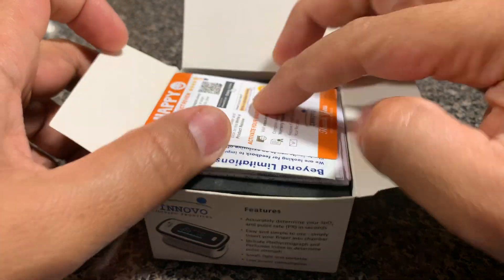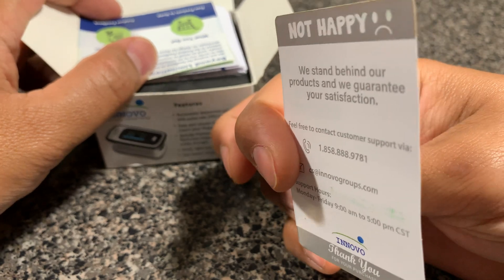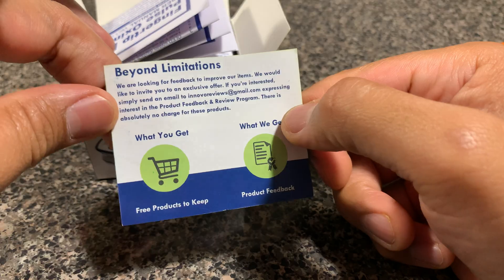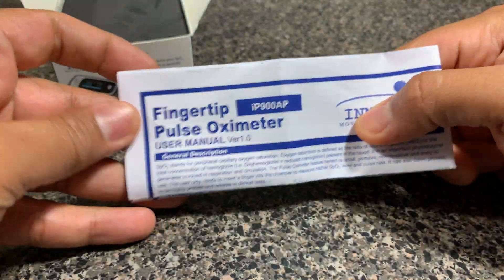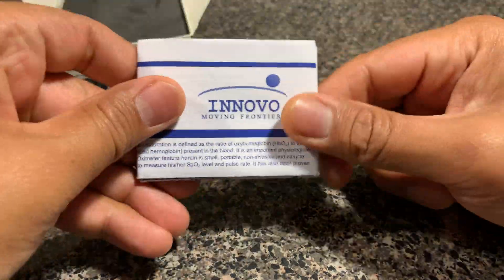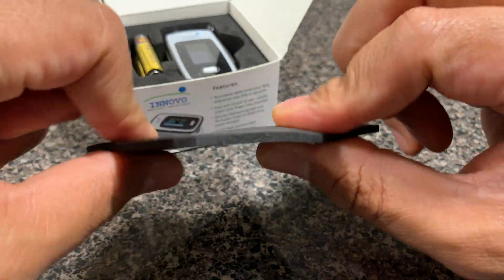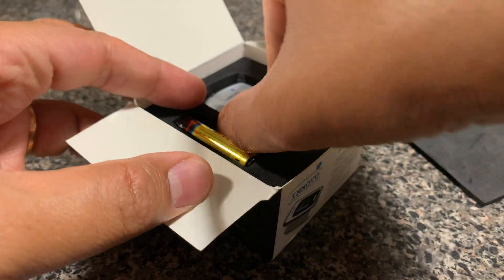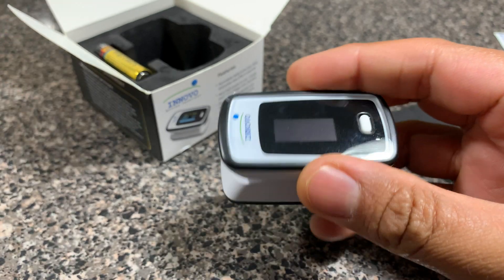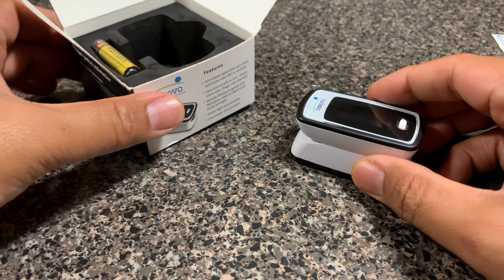Let me now open the product and show you what it contains. There is a little warranty card with information on how to get support if you need it, some kind of feedback card, and a user manual that comes with the unit. The unit itself comes in a nicely packaged foam-type material inside the box, and I think you can actually use the box for storing the unit when it's not in use. In my hands, you can see it's a fairly small device.